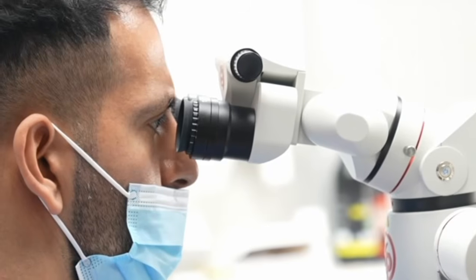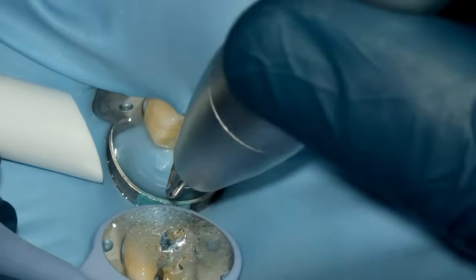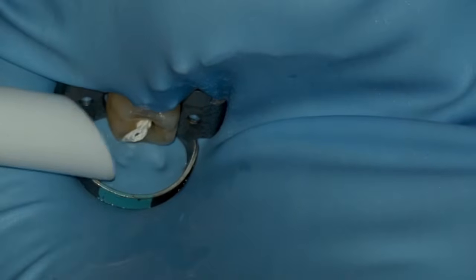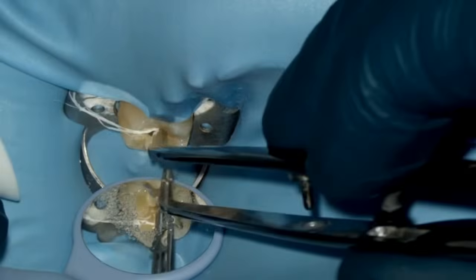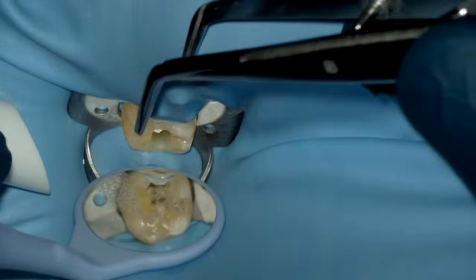Initially, when we opened up the tooth, there were no issues with rubber dam isolation, and we used a single tooth isolation technique as I'd already done the pre-endo build up. We opened the tooth up, and the nice element was that we were able to locate the canals pretty easily. What made that stage really easy was we did not destroy the anatomy of the floor of the pulp chamber.